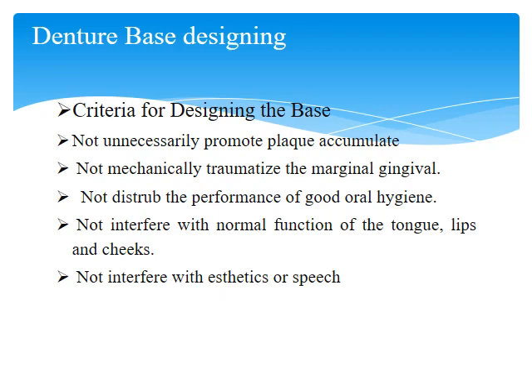The denture base designing criteria for designing the base: not unnecessarily promote plaque accumulation, not mechanically traumatize the marginal gingival margin, and not disturb the performance of good oral hygiene, not interfere with normal function of the tongue, lips, and cheek, and not interfere with aesthetic or speech.